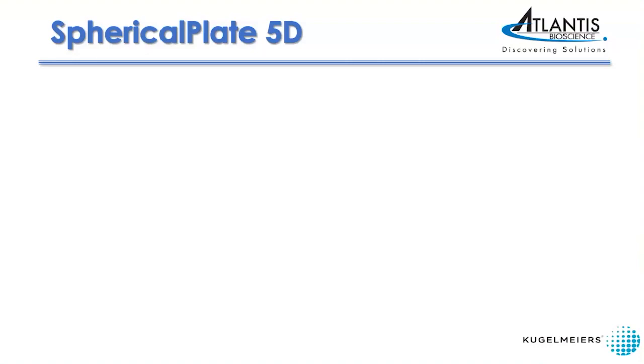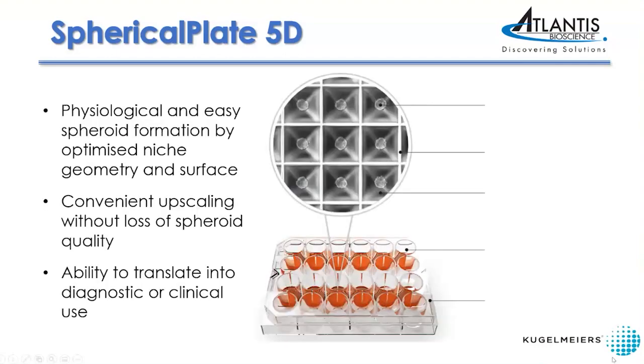Now let's move on to look at the 3D cell culture. One of the most common and simple techniques for spheroid formation would be the use of the hanging droplet method. However, the spheroid size that is formed in this method is often inconsistent and prone to human error. It is small scale and labor intensive, and although there are several commercially available surfaces that offer low adhesion properties, the cell differentiation resulting from random cell attachment is still a challenge here.